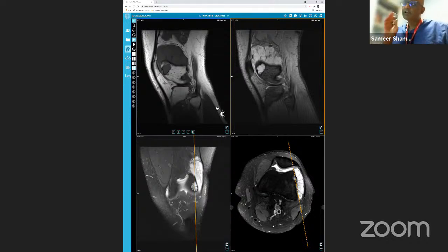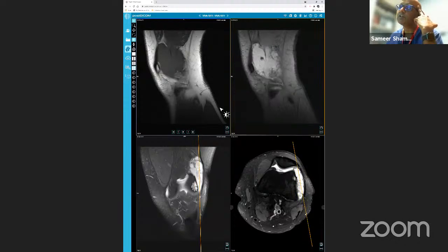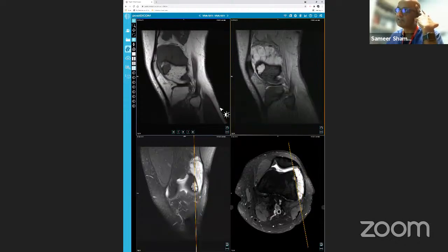You have a good approach to spotting the abnormality. You are struggling a little bit in putting things together and being swift in moving into the next segment. Keep in mind that in the VIVA, you just have to move from observation to interpretation to principal diagnosis to differential diagnosis and further management, even before the examiner asks. So in this case, I would say this is an MRI knee, then quickly go through. And when you get an MR of the knee, don't get scared if you get something that you don't know. Make sure that you see all the way from side to side. The pathology will become obvious, because when you get weird cases, the pathology will be present on the scan.